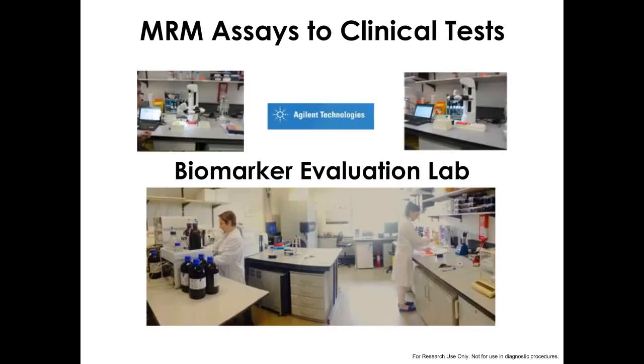And so what we did a number of years ago was to set up a small laboratory in which we simply take samples that are stored in a -80 freezer, digest them with trypsin on a workflow, and then put them into a triple quad mass spectrometer. All that happens in the laboratory is those simple steps, and everything is done by standard operating procedures. So this really is to test the analytical robustness of the methodology.